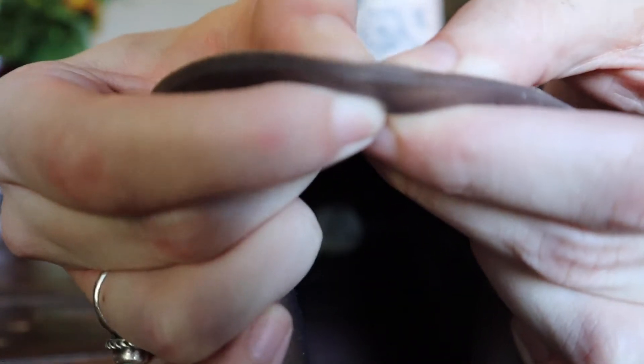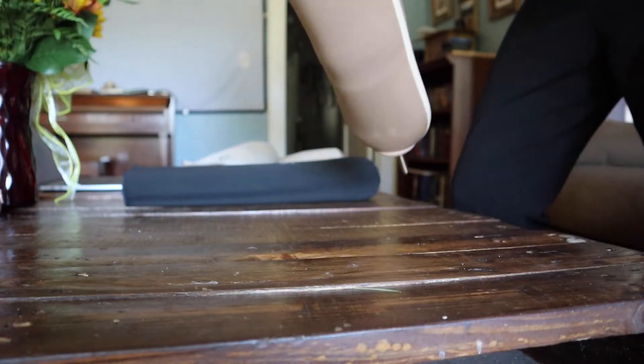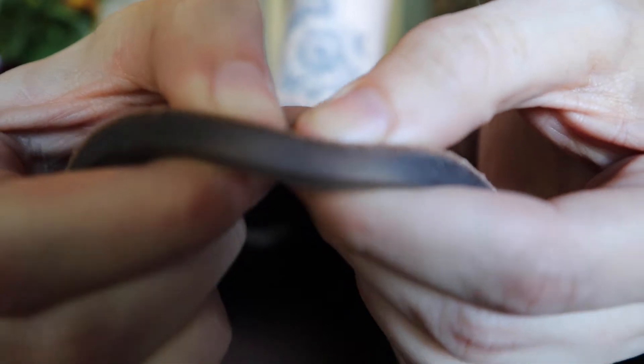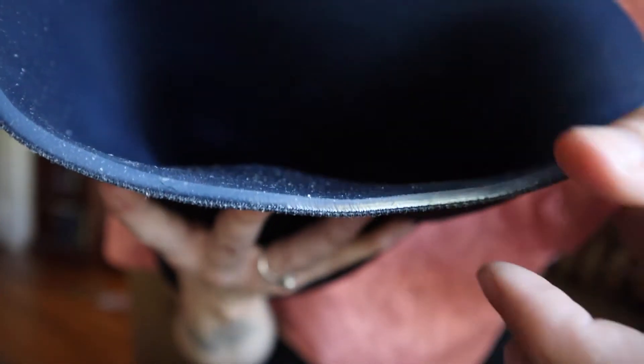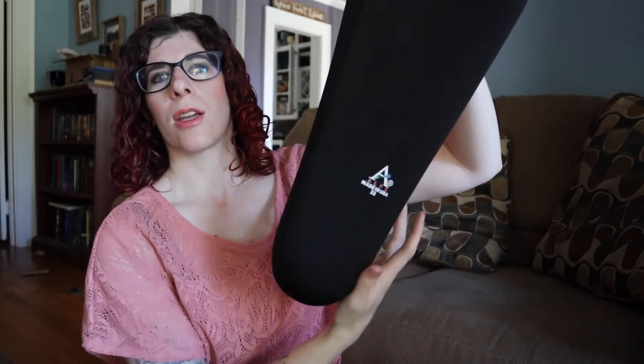Here's our three millimeter liner and here is our six millimeter liner — with the three millimeter you'll definitely feel more of that shock compared to the six millimeter. There are also tapered liners that are six millimeter in the front and three millimeter in the back, which can help with knee bunching, tightness, or difficulty bending the knee, especially for active activities like bicycling. Some liners are also thinner at the top and get thicker toward the bottom.